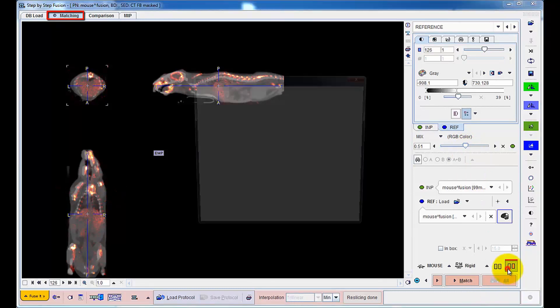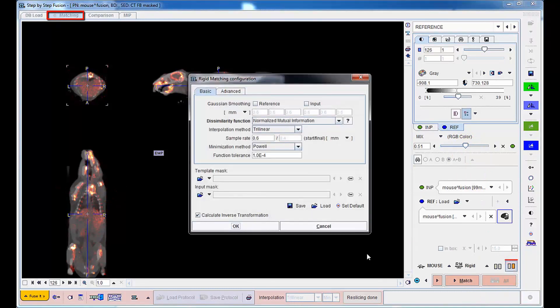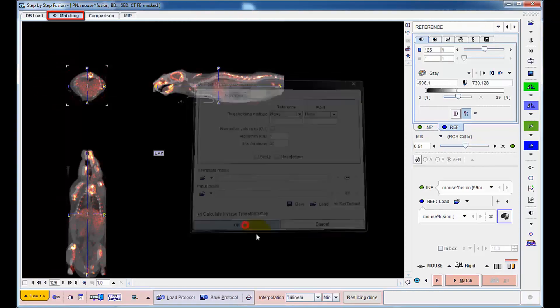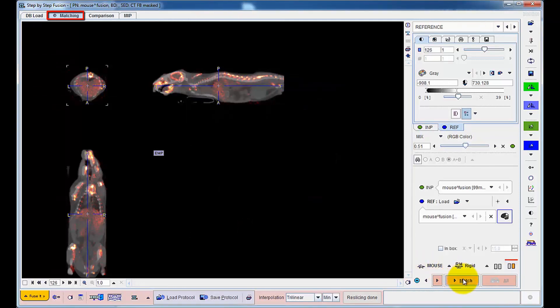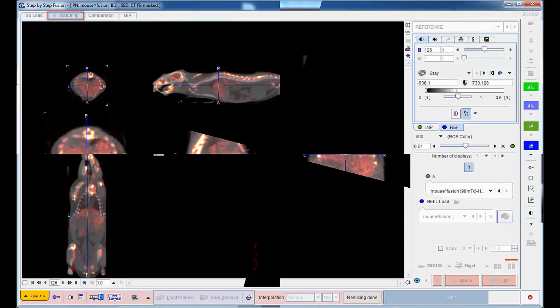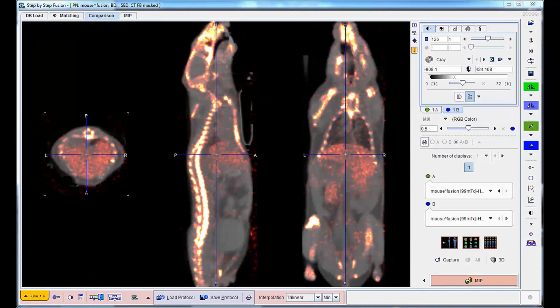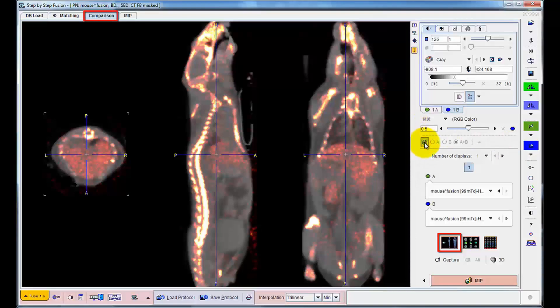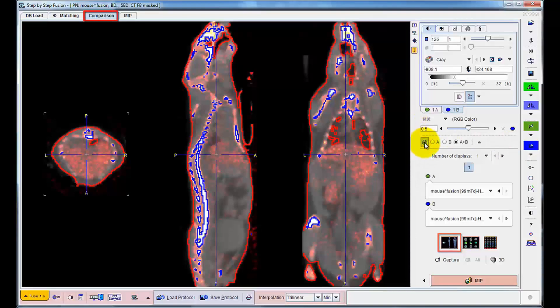Next, registration is configured for cross-modality matching and the processing is started. A few seconds later, the result is displayed and can be conveniently visualized in an orthogonal whole-body layout. Various fusion techniques aid inspection of the alignment accuracy.